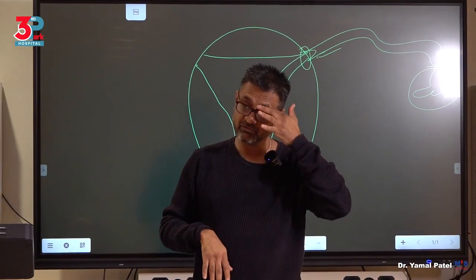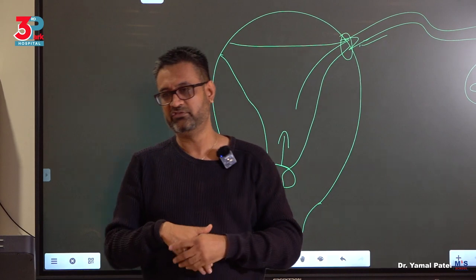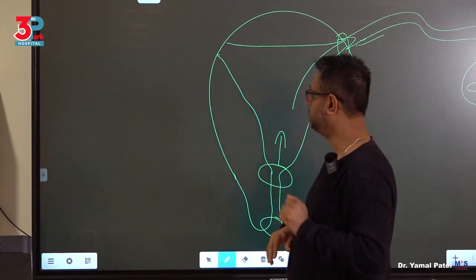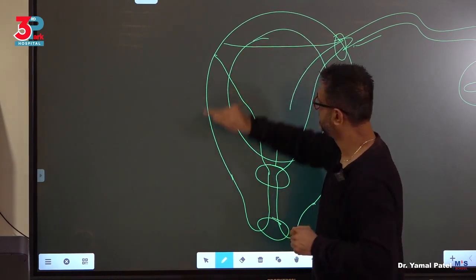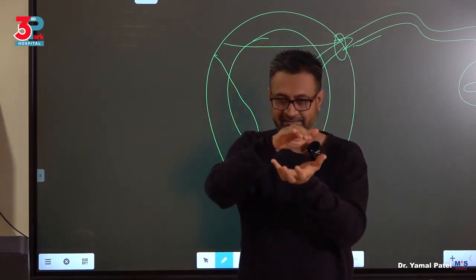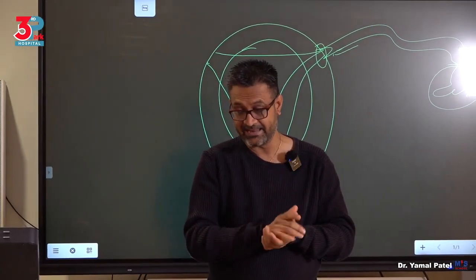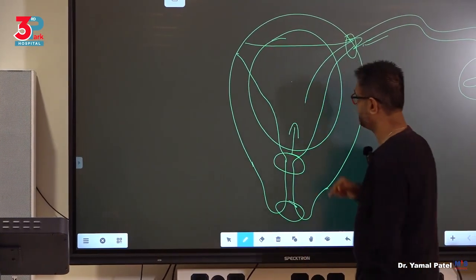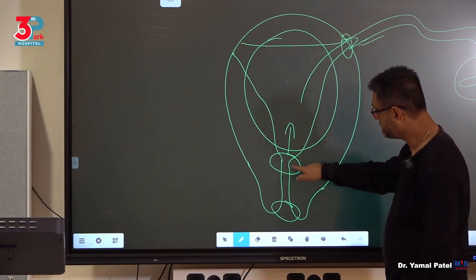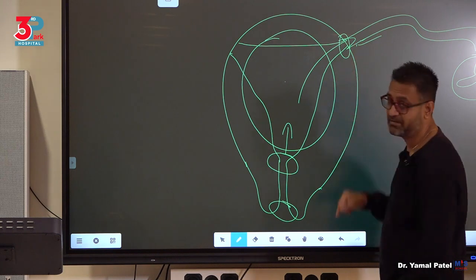But at the same time, your view might also be compromised if all the fluid is just being pushed away. So that is what we need to understand. How much do I distend this area so that the fluid remains inside, not too much going outside. It will go outside, but not too much. And I get a good view. So that is the intrauterine pressure I'm talking about, okay? So you should know what valve pressures these ones open up at.